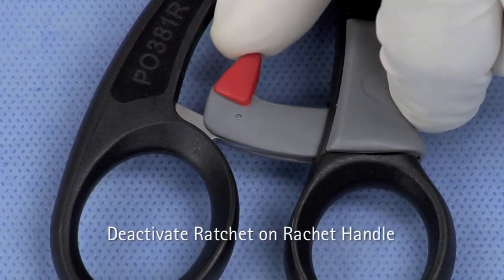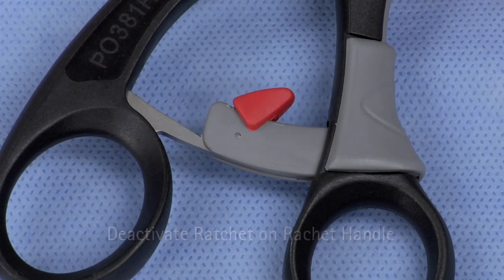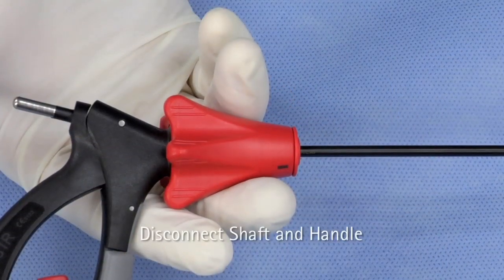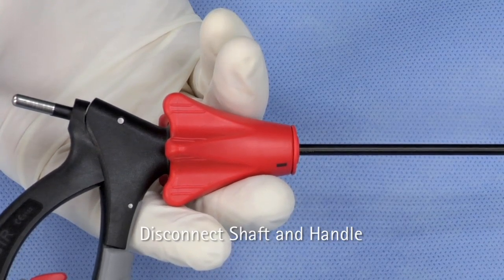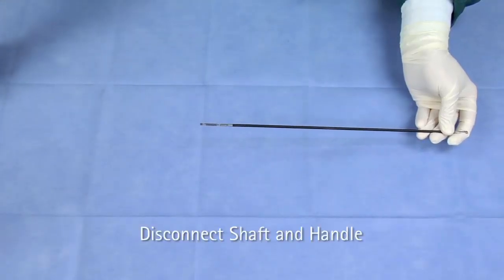If you are using the ratchet style handle, deactivate the ratchet by flipping down the red toggle switch. Pull the rotation knob back and let the movable part of the handle move downwards. Remove the shaft by pulling the instrument shaft out of the handle.